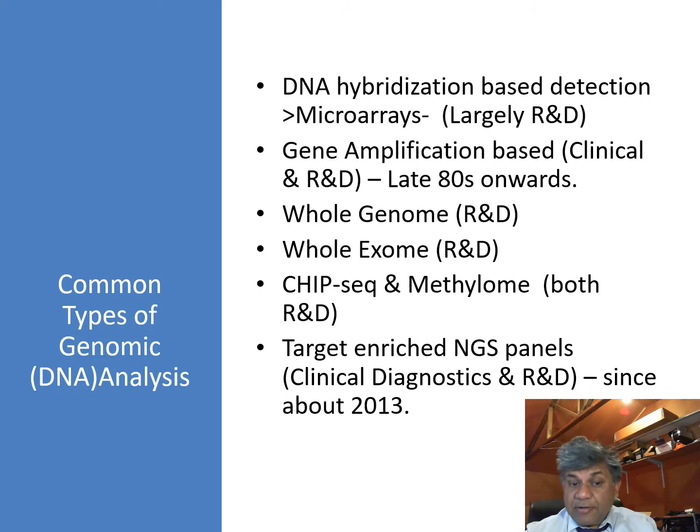I previously described common types of genomics analysis, and today I'm going to be talking about PCR, which is related to gene amplification based testing, which has come on board since the late 1980s. Of course, in my previous talk, I talked about target enriched NGS panels.